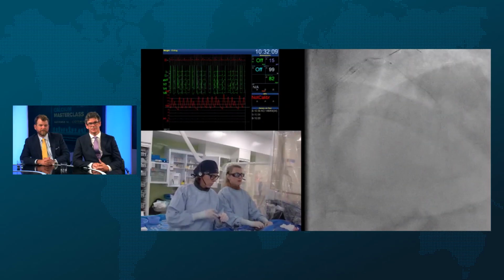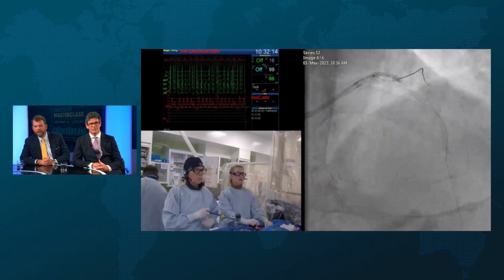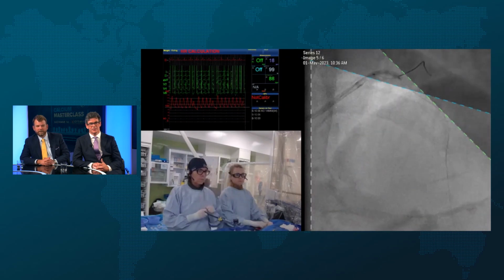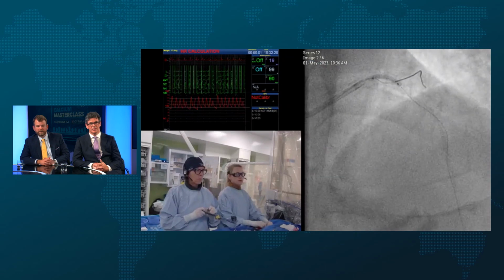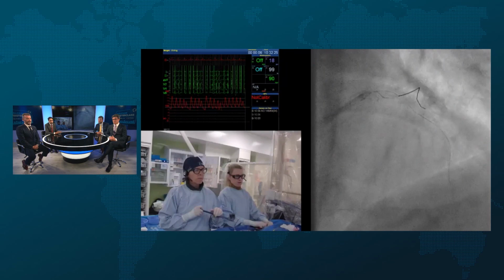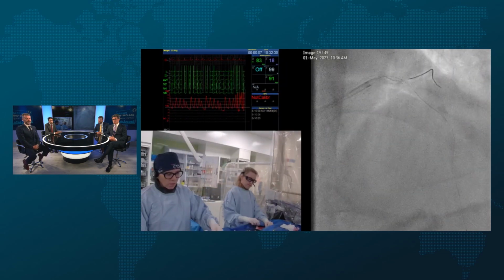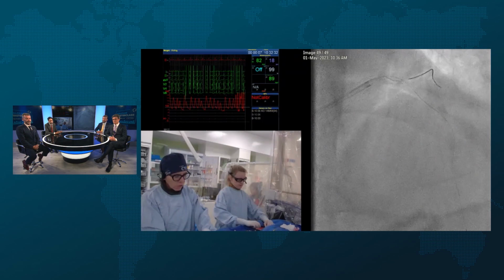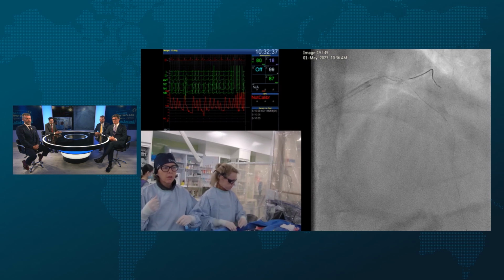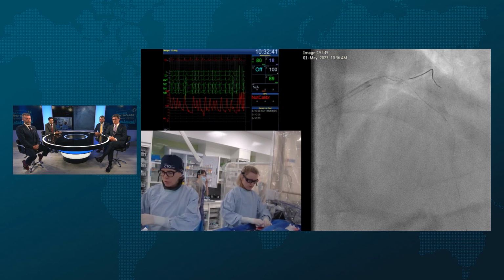And I guess the other thing about the setup that we didn't mention is you've got the Rampart radiation protection in place as well, which is great for the team to be able to work in essentially a radiation-free environment. Margaret, you're pretty much used to that in the US already now, aren't you? Sorry, James, I missed that question. Rampart and what it's done for your interventional practice. Yeah, so we've got two systems, two rooms we use for the complex cases. It just lives in those two rooms, and we've got really used to using it.